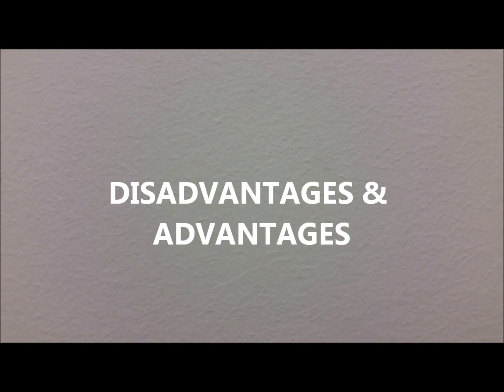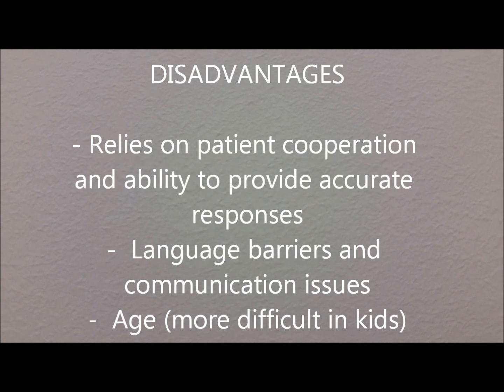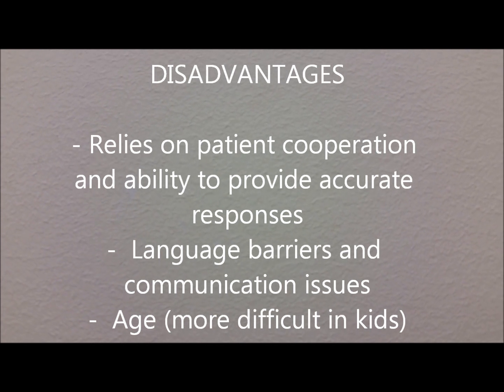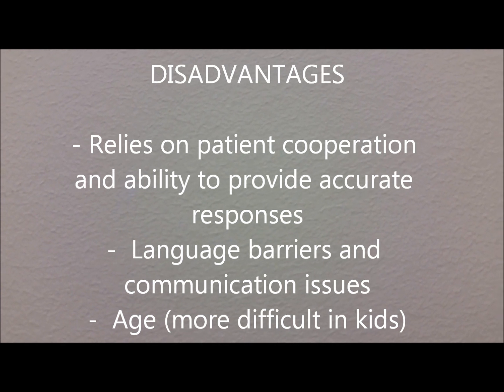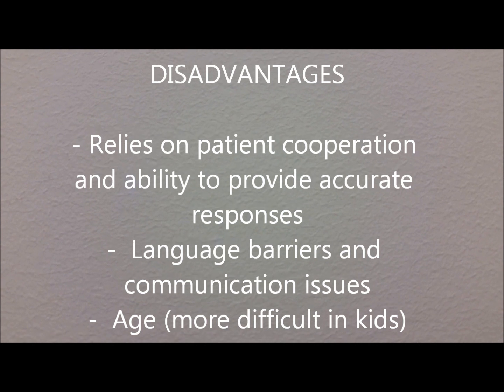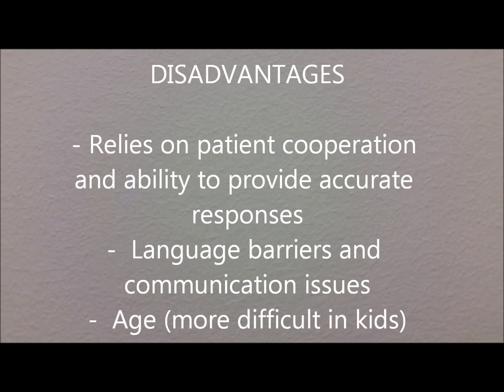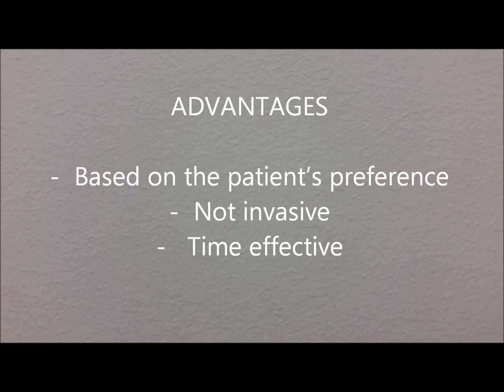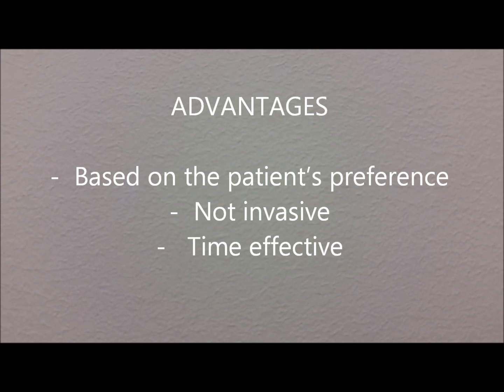However, it can be influenced by various factors. Disadvantages: it relies on patient cooperation and ability to provide accurate responses. It can be difficult when there are language barriers and communication issues, and age. It can be more difficult with children. Advantages: it's based on the patient's preference, it's not invasive, and it's time effective.